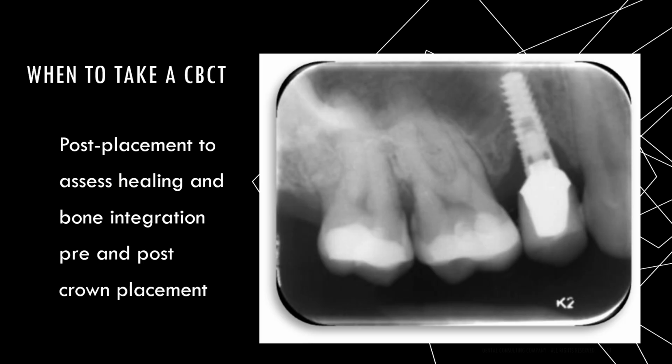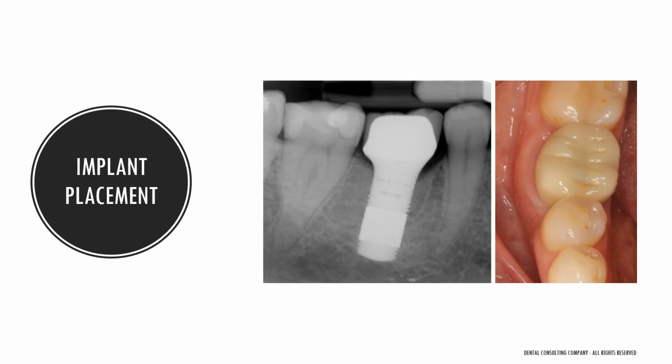Another time it will be helpful to take a CBCT is post-implant placement to assess integration into the bone and to see if there's any compromised areas of healing. After reviewing the diagnostic imaging needed to see if a patient is a candidate and the process for selecting an implant, it is helpful to understand how an implant is placed.